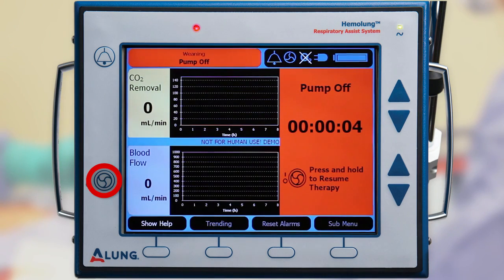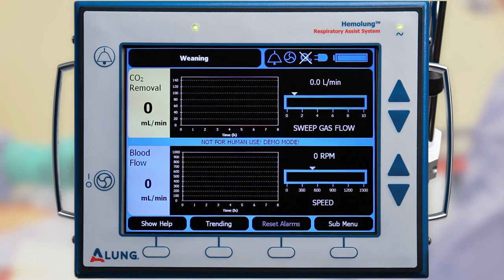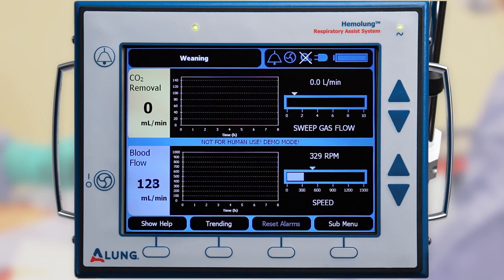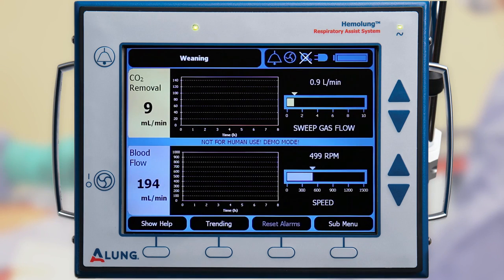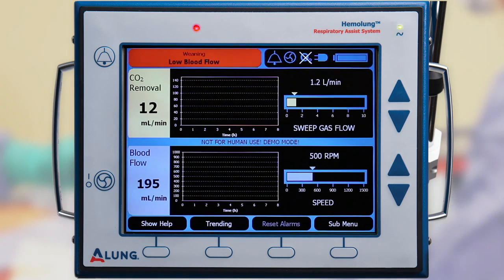Press and hold the pump start/stop button to start the pump. Once initiated, the system will run at a default pump speed of 500 revolutions per minute and sweep gas flow rate of 1 liter per minute. The pump speed and sweep gas flow rate can be slowly adjusted to the desired settings while carefully monitoring the patient.